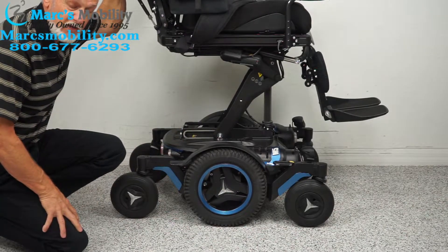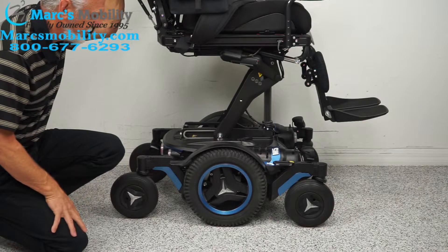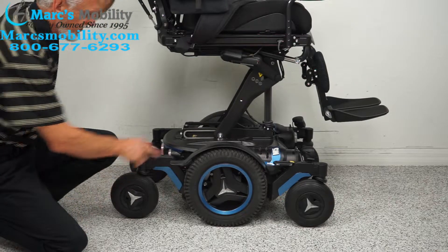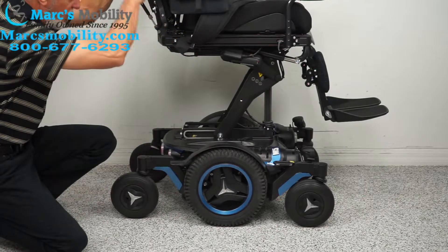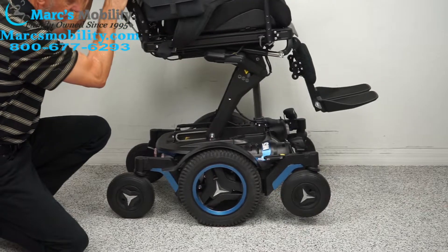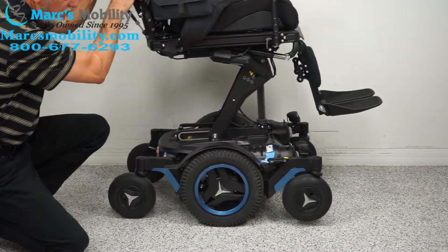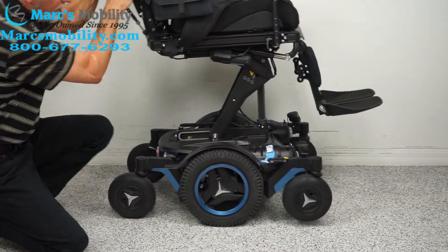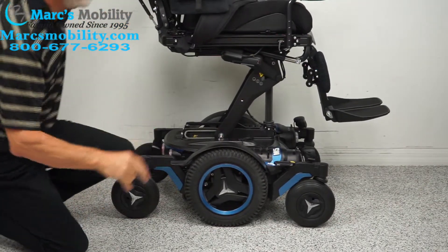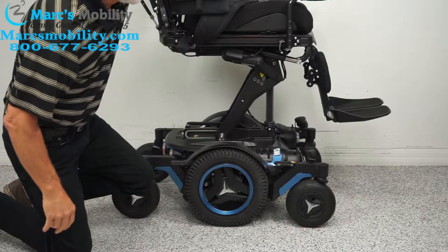This chair is 450 pounds, so it's a heavy chair. It also has suspension in the back — if I push down you'll see the fork move. You can see how the suspension works in the front as well. You have two motors on this chair — let me turn the chair around so you can see them.